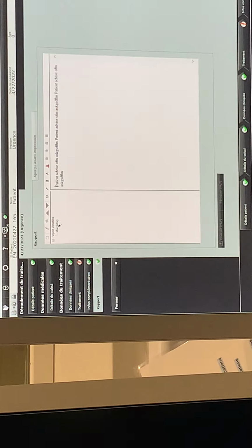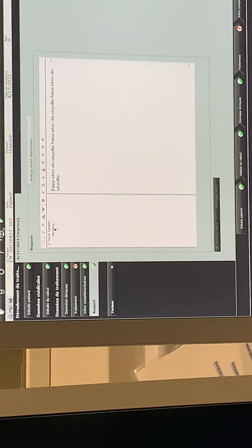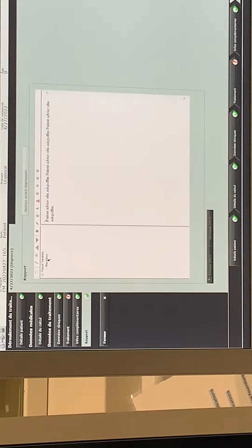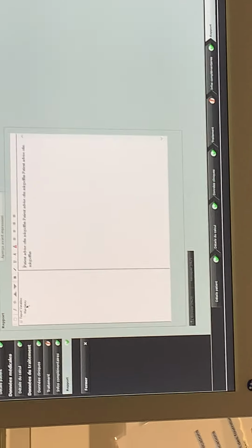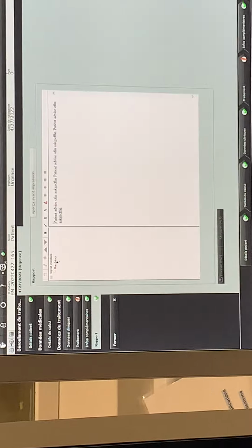Put Lieberman on that tomorrow. Is there an online training, or something? You remember all the explanations you're giving us. He doesn't understand French. I'm gonna ask him to send this. Is there a video or something that I can have? We will do it. You have operating manuals where you can find all of this information.